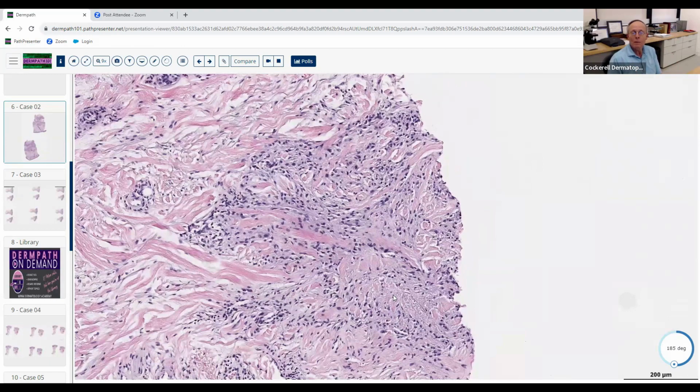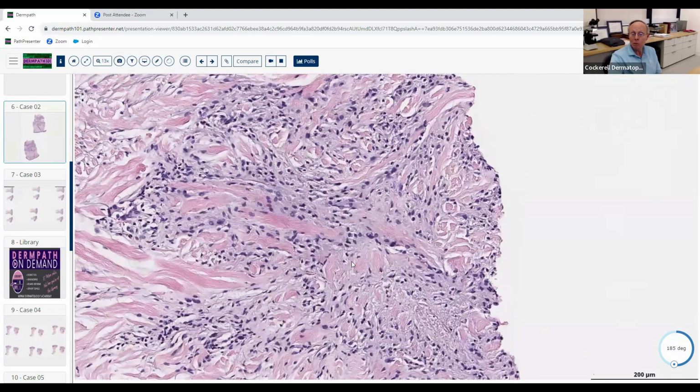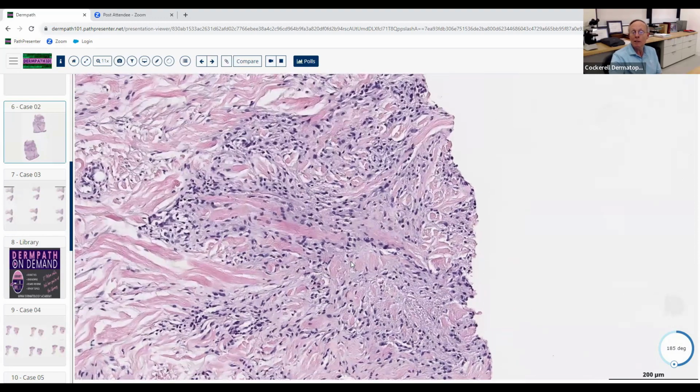Now, let's say we just have this field alone. We don't have the biopsy to look at the so-called layer cake of granulomatous inflammation over the diffuse pattern. Let's say we have only this. What's in the center of the palisades of the three main palisaded granulomatous dermatitis? Is it like mucin and fibrin? Mucin in which disease? Granuloma annulare. Good, and we see that here, right? This sort of bluish gray material that's sitting in the center of this palisade right here. So this is mucin. That's what you see in the center of the palisade in GA.